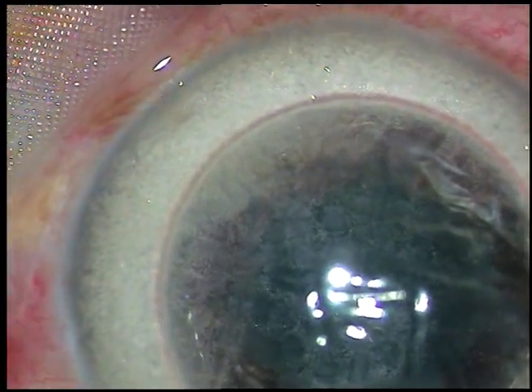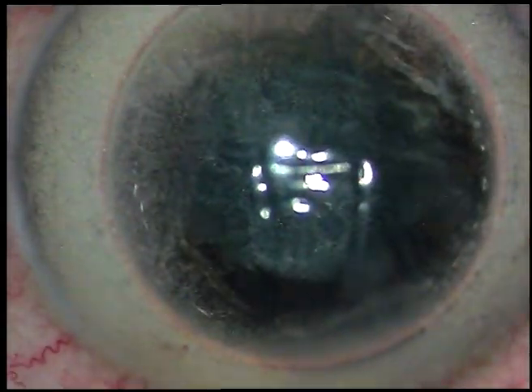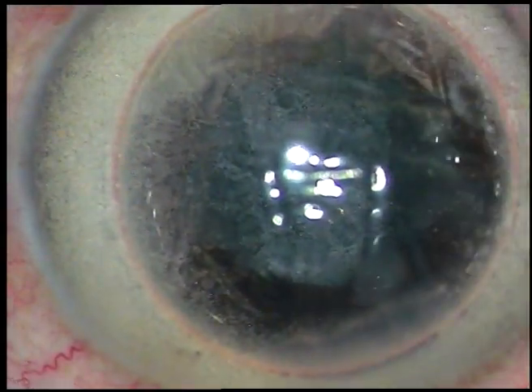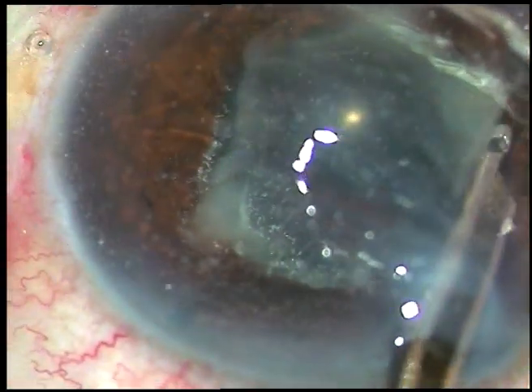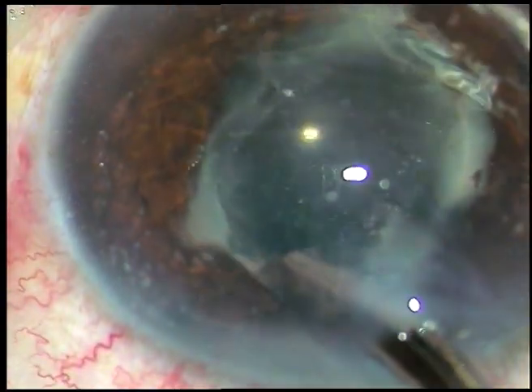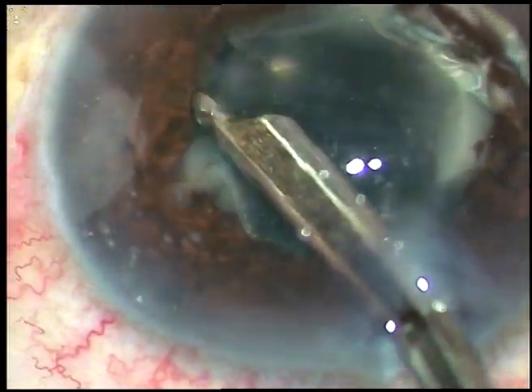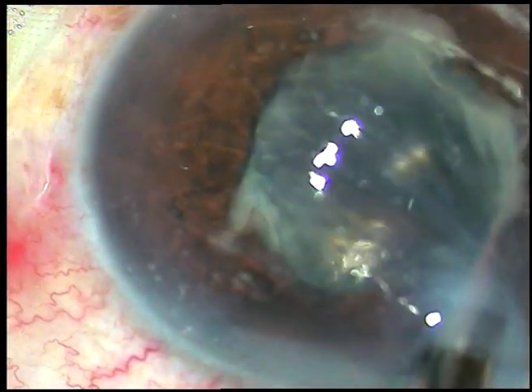This patient has undergone several attacks of anterior uveitis in the preoperative period. The mistake that was made is that we didn't do the surgery under systemic steroid cover. In such cases, we should always perform surgery under steroid cover.